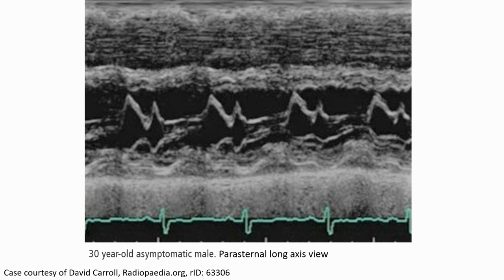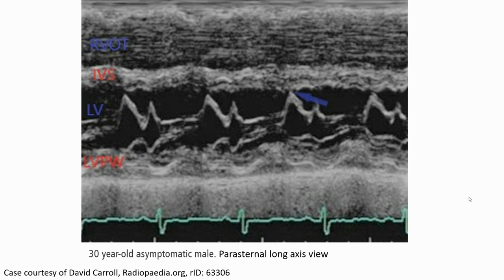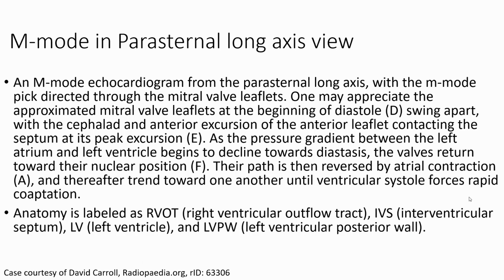Here is the parasternal long-axis view of an echocardiogram. This demonstrates the relevant structures and landmarks we are looking for. Shown here is the M-mode in the parasternal long-axis view, with the M-mode cursor directed through the mitral valve leaflets.